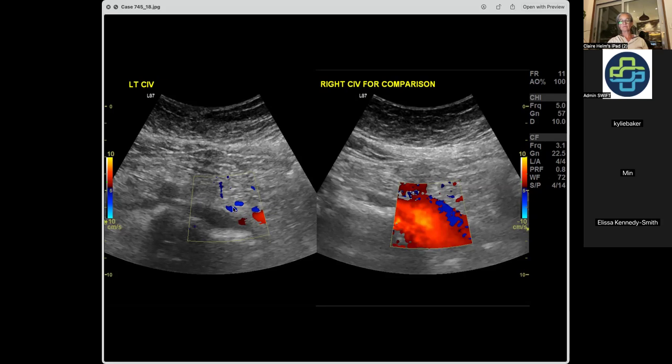takes a minute. So why don't we just do that? Surely that's much more efficient. One of the reasons that we say, first of all, I will sometimes do that sort of scan.